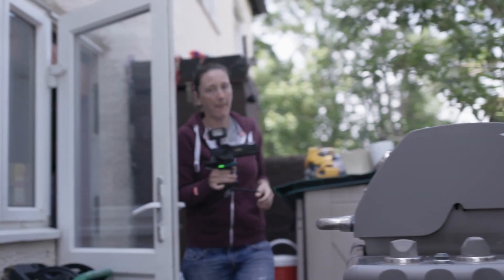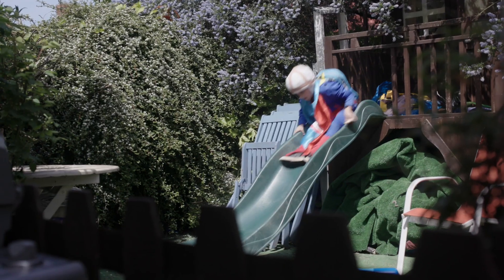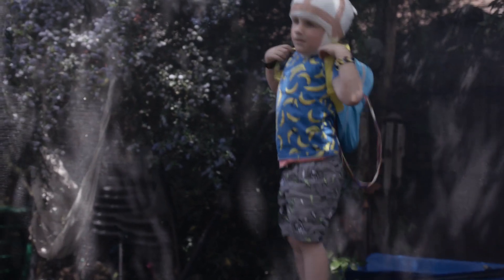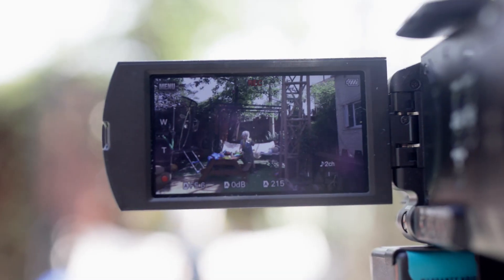If your child moves into another room, bring the camera through and reposition it. Alan's the kind of kid that you can't keep still, so it's amazing that we can have it done at home and he can still run around. It's just a normal day for him and it makes no difference — and that's amazing.